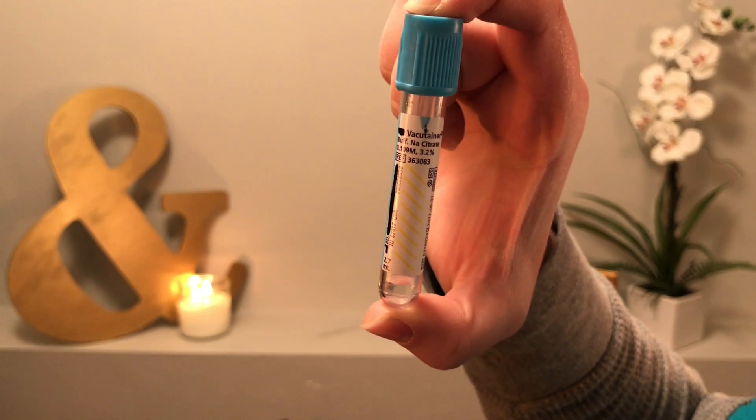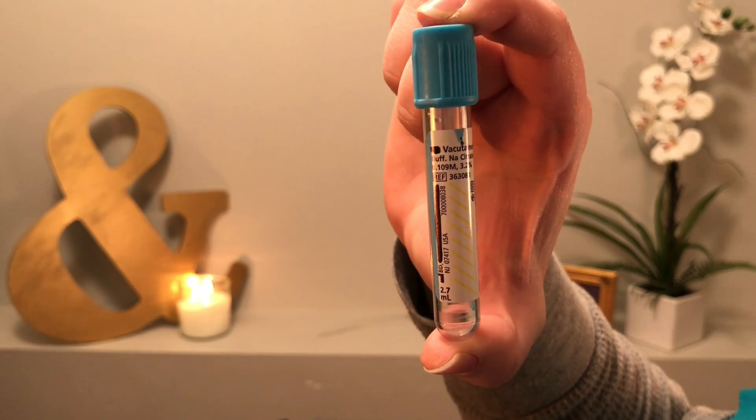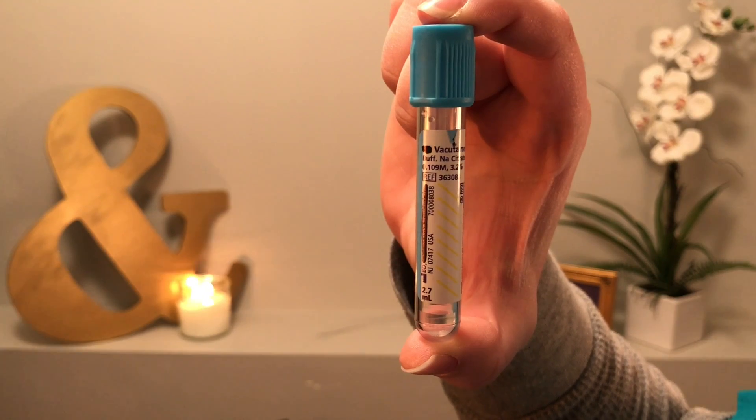The first tube we're going to talk about is called the sodium citrate tube. It is a light blue top. This one is a light blue top and it's got a little bit of liquid down at the bottom. What these tubes are used for is coagulation labs — so we're checking a prothrombin time. We usually just say PT or PTT.